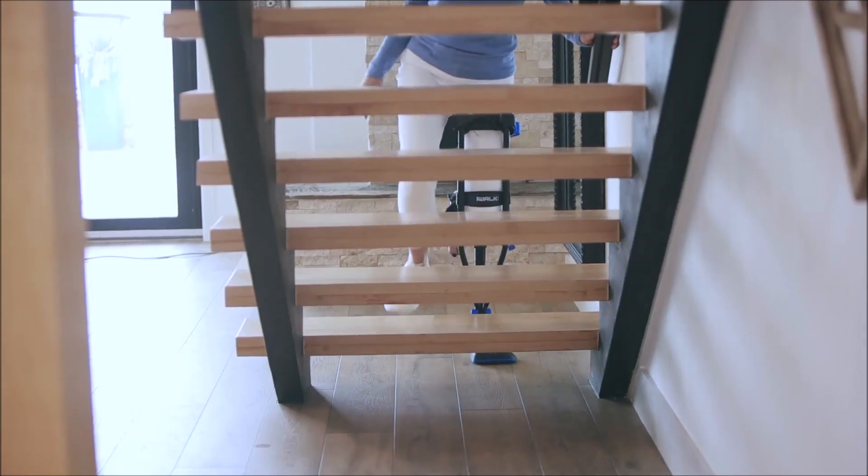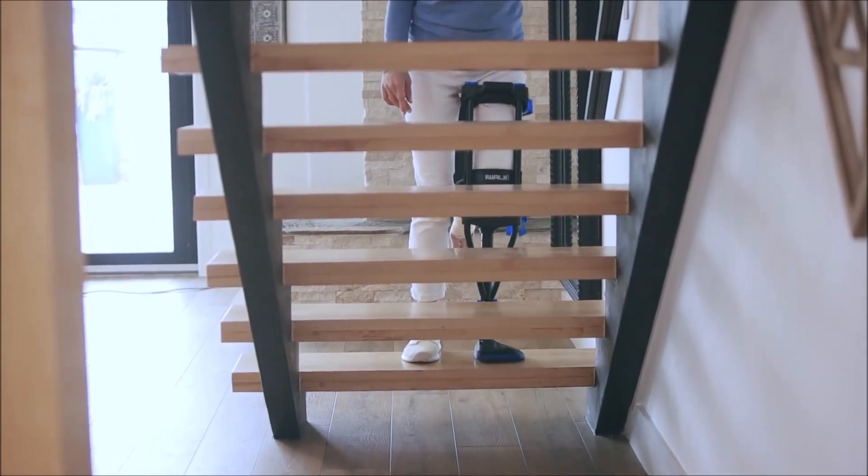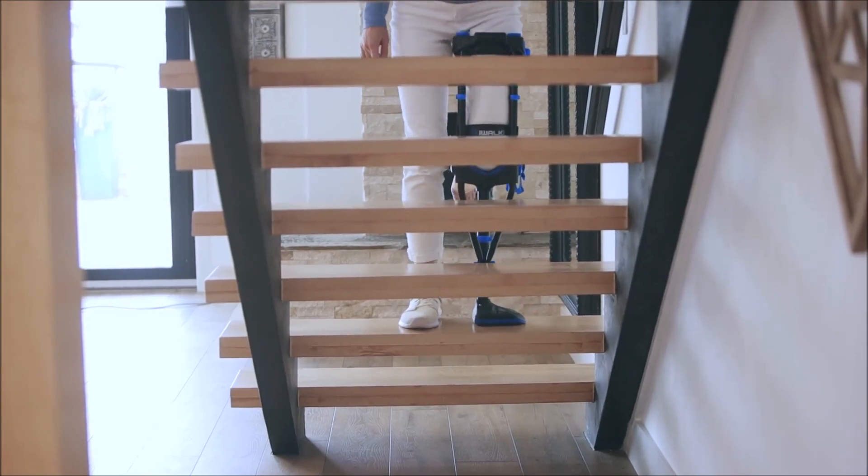To go up, start with your good leg. Follow with the iWALK leg, going one step at a time, then repeat.